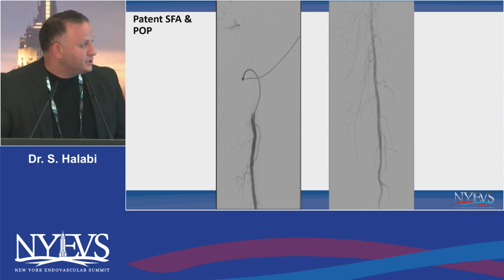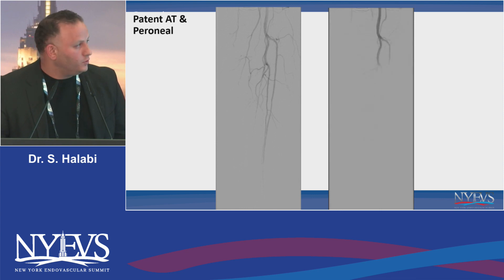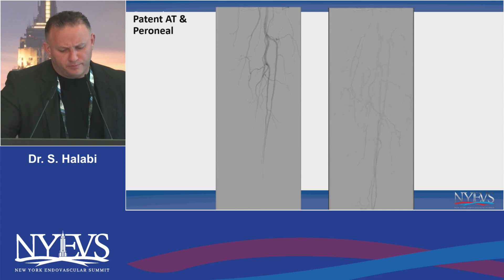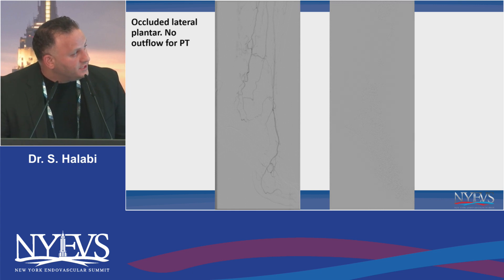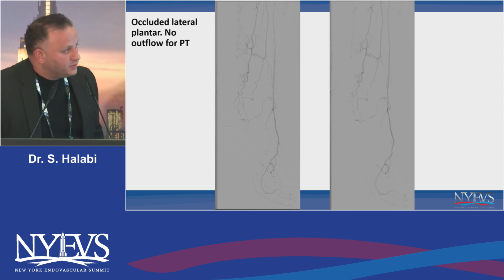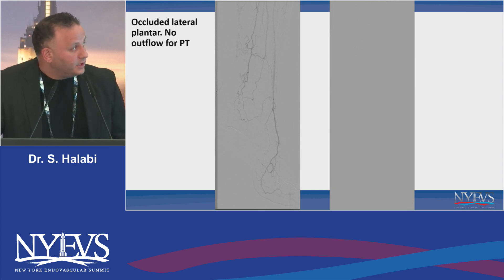This is essentially the angiogram. What you see here is a patent SFA and pop. We go to the below-the-knee vessels, and the AT is nice and patent, and the peroneal is small but kind of goes down. The AT comes all the way down, the peroneal comes down and gives some collateral, but the posterior part of the foot is not getting any blood and she's not healing. Her smoking and not well-controlled diabetes is not helping — this is what I mean by a no-outflow lesion.